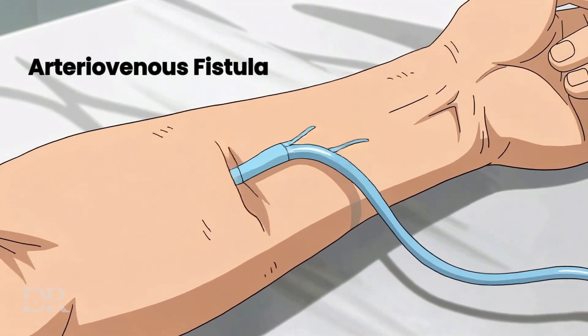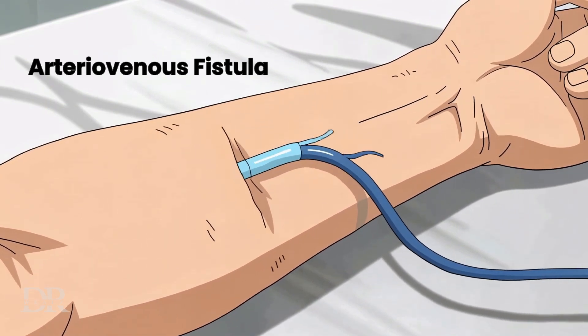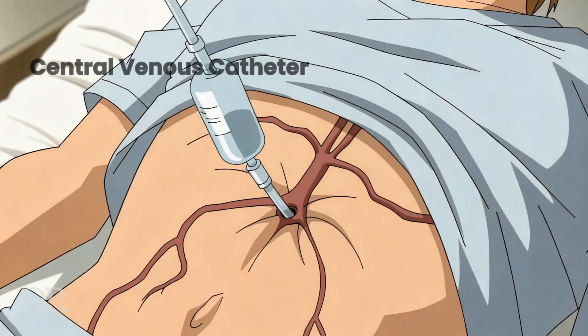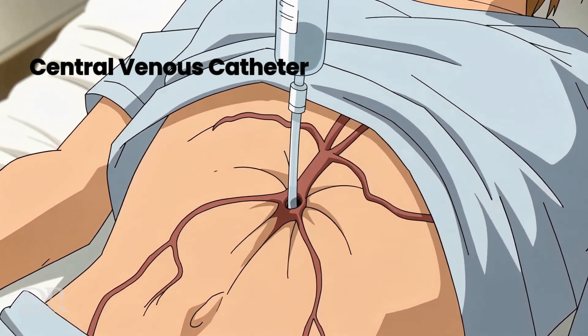Arteriovenous fistula: surgically connecting an artery to a vein, making it stronger and easier to puncture. AV graft: using a synthetic tube to connect an artery and vein. Central venous catheter: a temporary tube placed in a large vein.